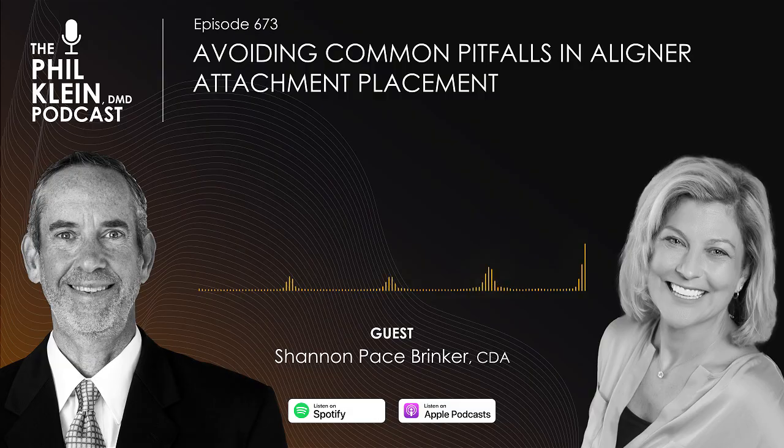If a patient loses an attachment, do they even know? Because again, it's clear, you can't really see it. Now, the one thing I will say about the Tetric aligner is that it is translucent. The beauty of that is if the patient's teeth are darker and we use a darker shade, this has a chameleon effect. It's just one translucent shade. That's a big plus. But the second piece of this is if they lose the attachment.